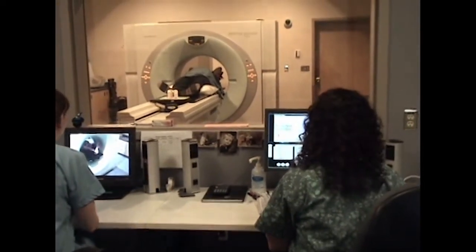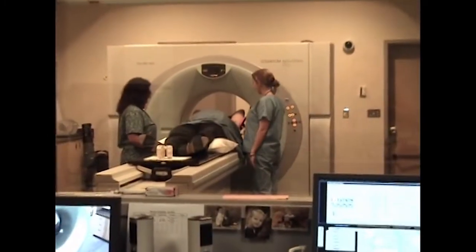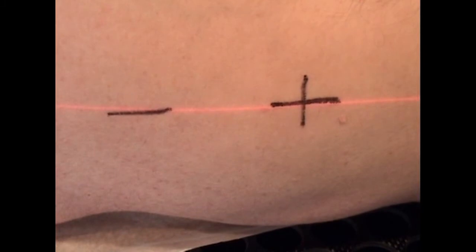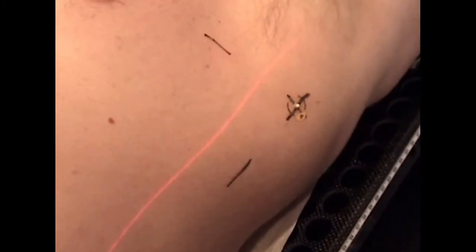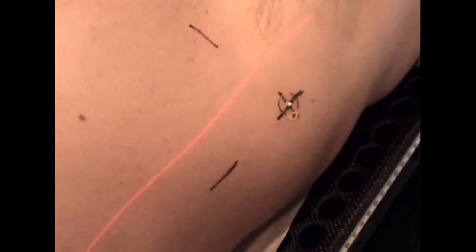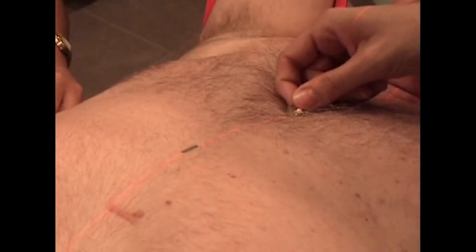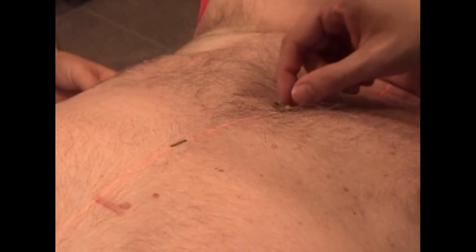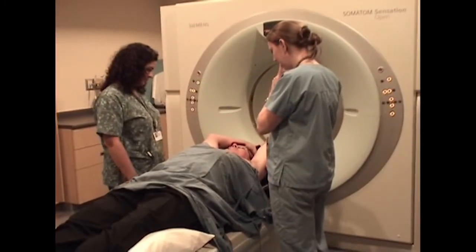The radiation therapists will come back into the room once the scan has been completed. They will then place tattoos at the location of each of the marks on your skin. The tattoo is a dot of sterile ink placed under the top layer of skin with a sterile needle. They will not wash off when you bathe or shower. The tattoos are important as they are used to accurately position you for each radiation treatment session.